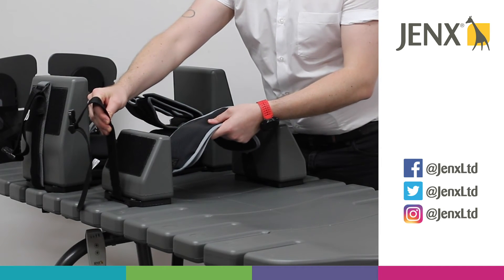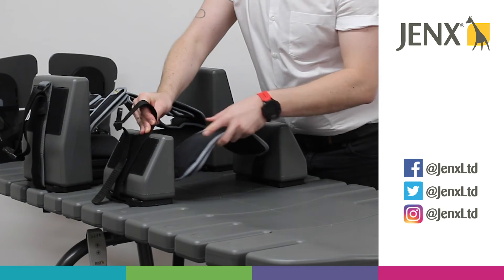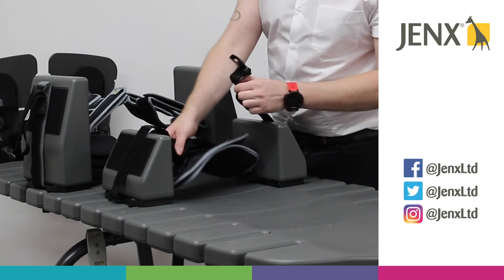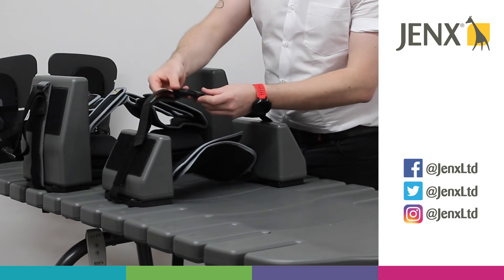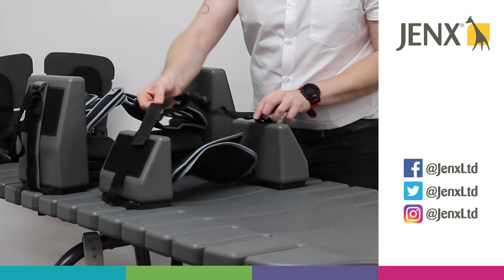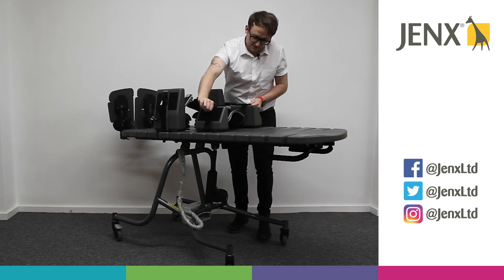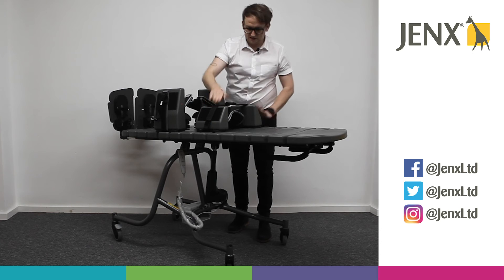If we pull in one side more, we apply some pressure and then stick the velcro onto the side of the pad. We're then able to clip the safety strap on, adjust it to be nice and tight, and stick it back onto the velcro.